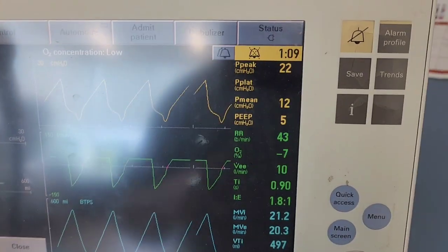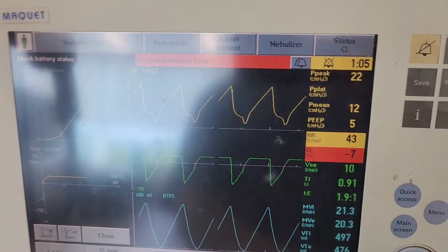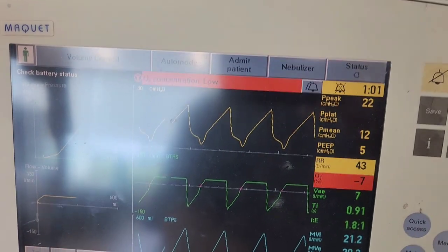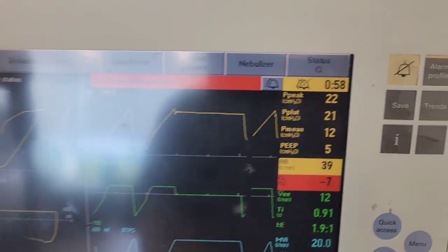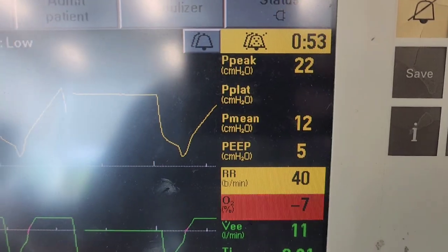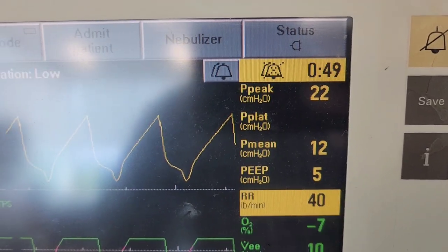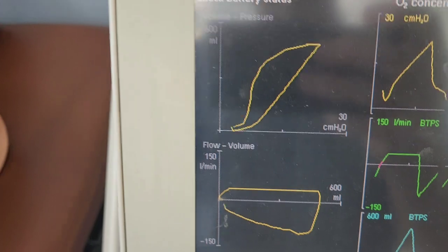Okay, I'm back. So let's do the inspiratory hold now that we added one spring for compliance. We want to do this at the peak inspiration. Hold it and let go. And now you can see that plateau pressure. That was 21. It was so quick. So keep note of that. Calculate what static compliance is. Okay? And we saw what the loop looks like.